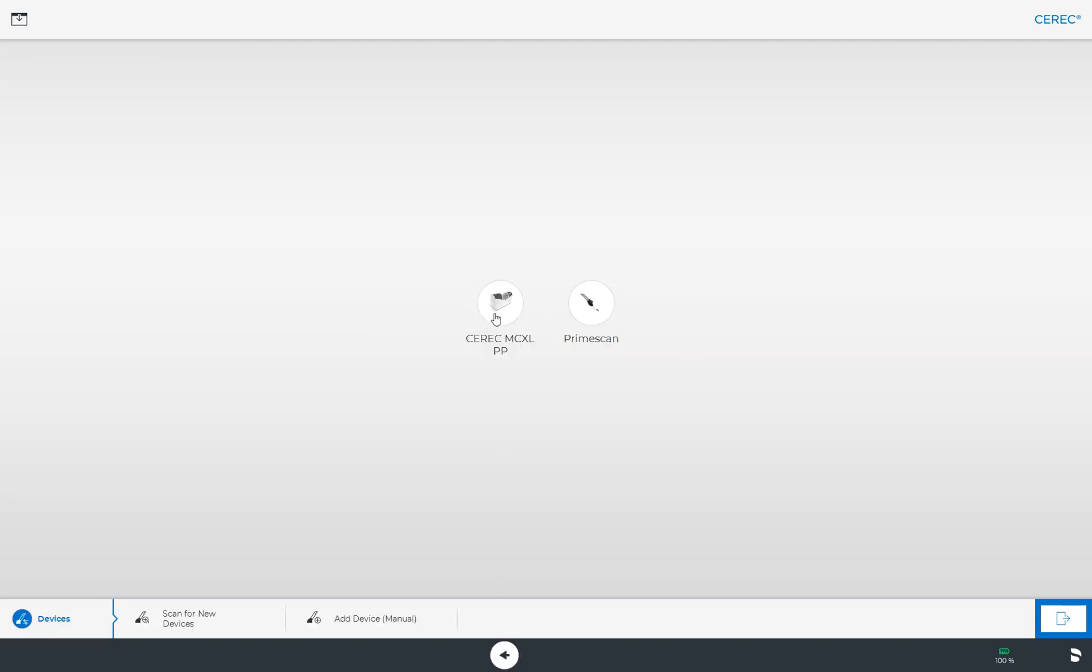Depending on how many devices are connected to your AC, they will be listed here and can be configured. We can also conduct a search for a new device or add a device manually. To see the procedure for adding more devices, you can watch our video tutorial on the topic device management.